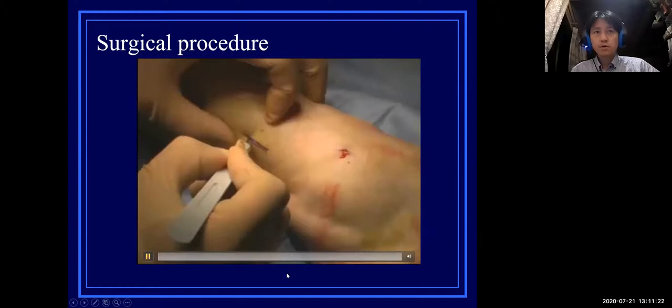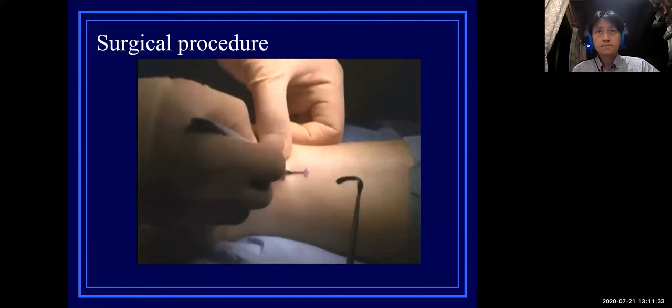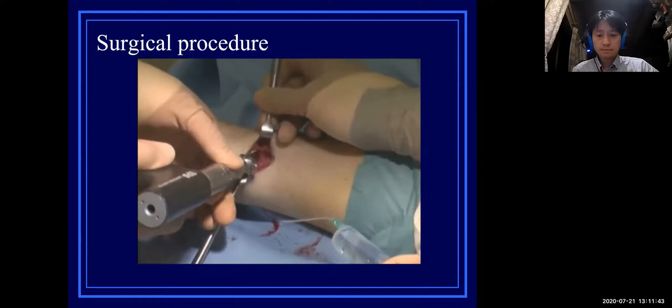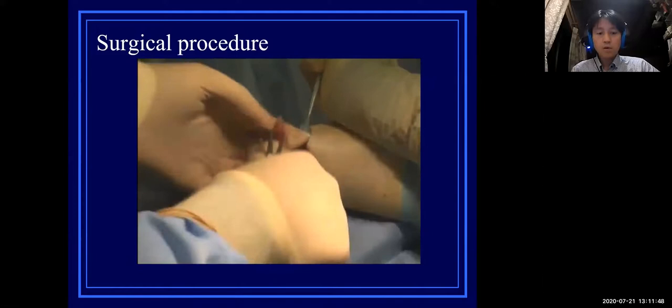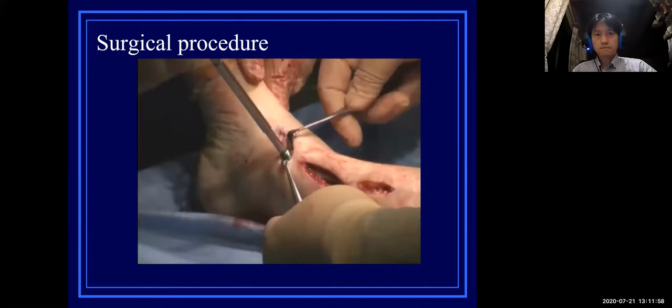I will show the actual surgical procedure. The first step is osteotomy of the fibula. Next is tibial osteotomy at five centimeters proximal from the tip of the medial malleolus. Iliac crest or beta-TCP will be harvested, and the fragments are fixed using a locking plate.